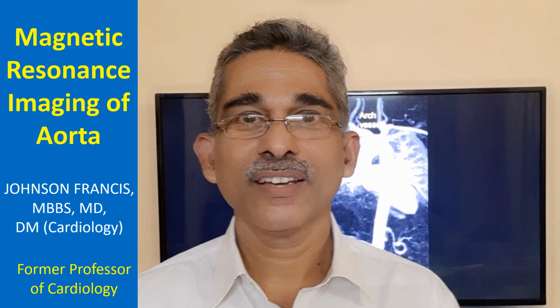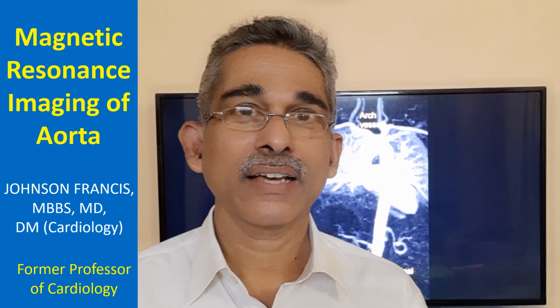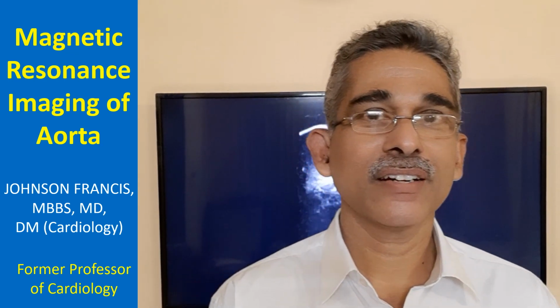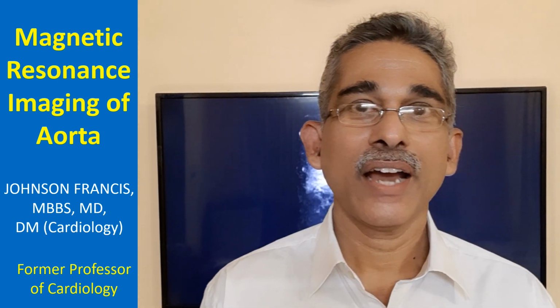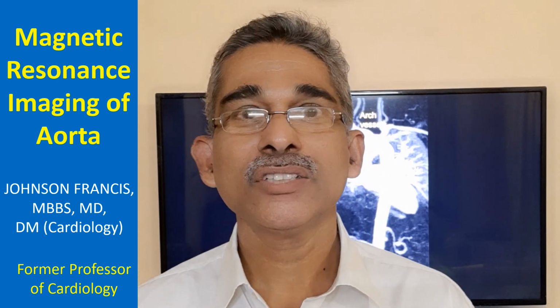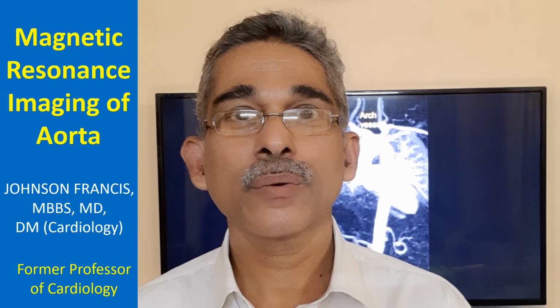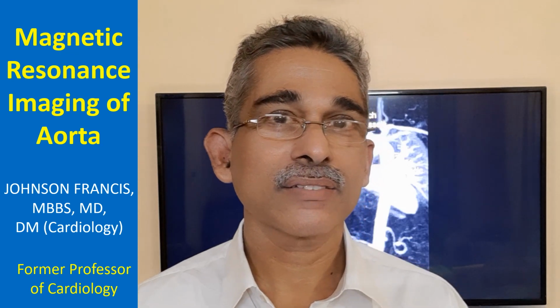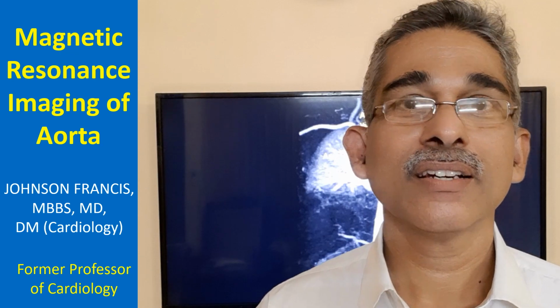Magnetic resonance angiography is often called dye-less angiography because you can get a contrast of the blood vessels even without injecting iodinated radio contrast as in conventional angiography. Hydrogen nuclei, which are plenty in blood, have a change in their characteristic when exposed to high frequency radio signals. So this is the basis for magnetic resonance angiography, earlier called nuclear magnetic resonance.